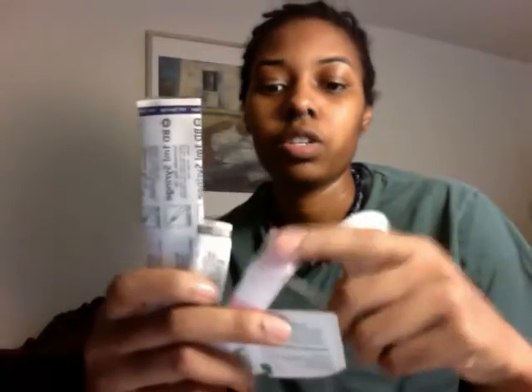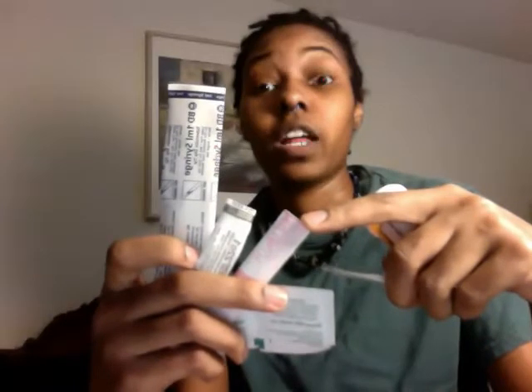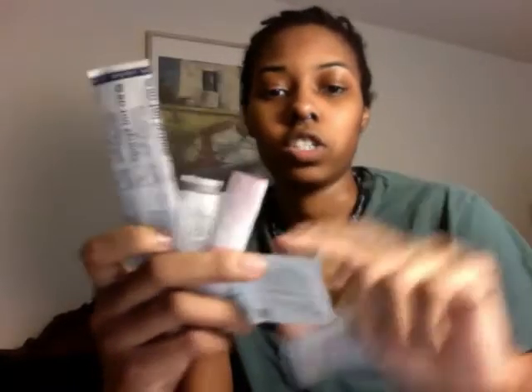Alright, let's get to it. I have all my supplies here. I've got my one-milliliter syringe, my 18-gauge one-and-a-half-inch needle for drawing, a 22-gauge one-inch needle for injection, two alcohol swabs, a band-aid, and my T.